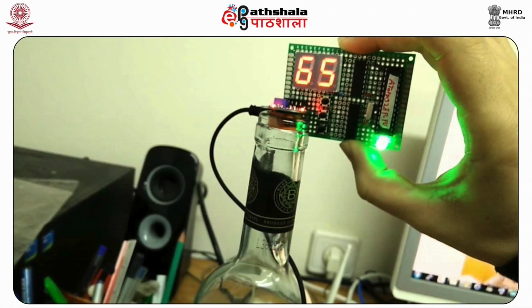From the platinum electrode, the electrons flow through a wire which is connected to the platinum electrode on one side and an electrical current meter on the other side. The protons migrate through the lower part of this cell and combine with electrons and oxygen to form water molecules. The more alcohol that gets oxidized, the greater the electrical current that will flow. The electrical current is measured by a microprocessor, which then calculates the BAC.